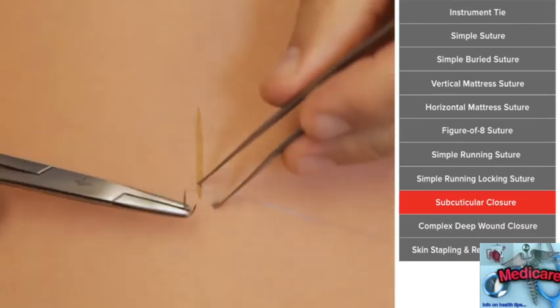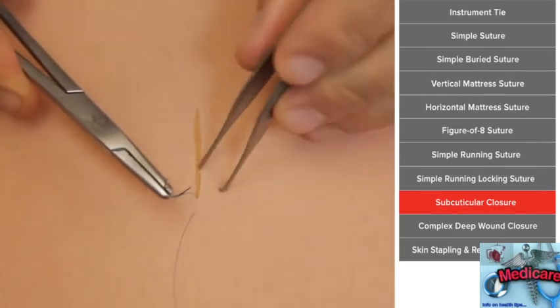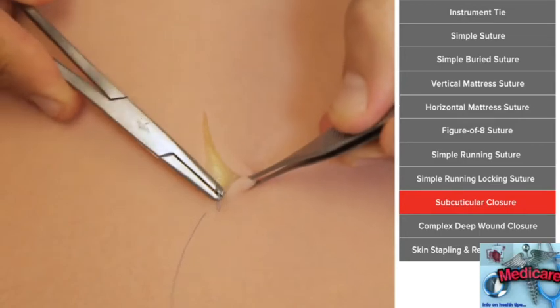And now what we're going to do is run a stitch under the skin, and this can be done either with permanent suture or absorbable suture, and I'll demonstrate here with permanent suture.